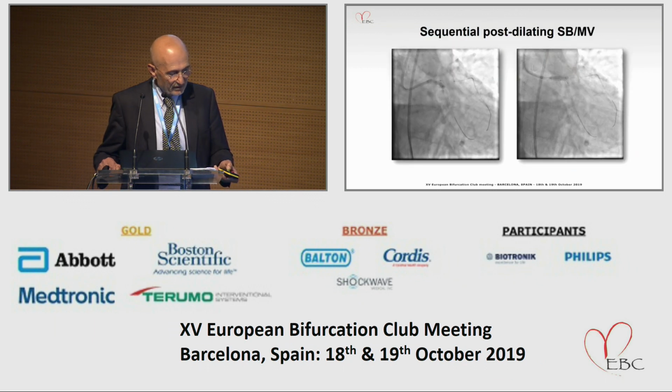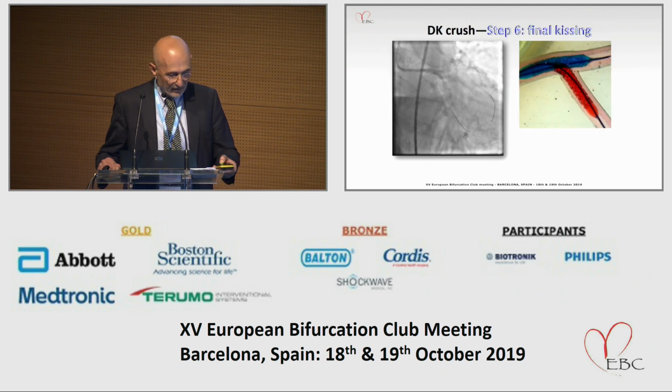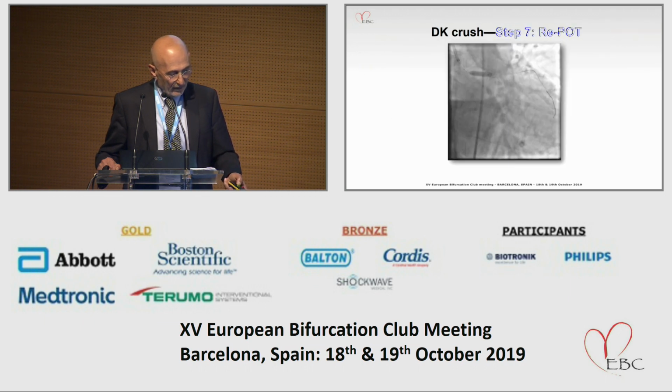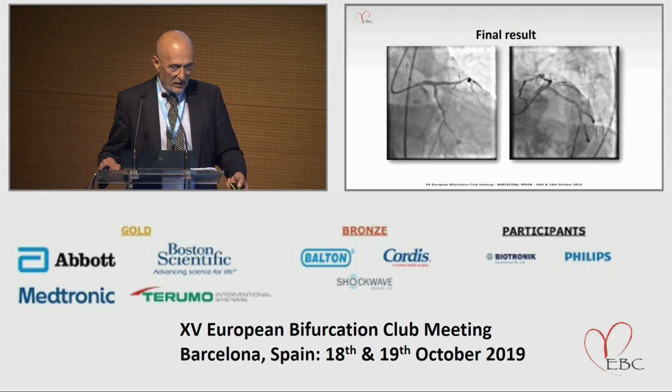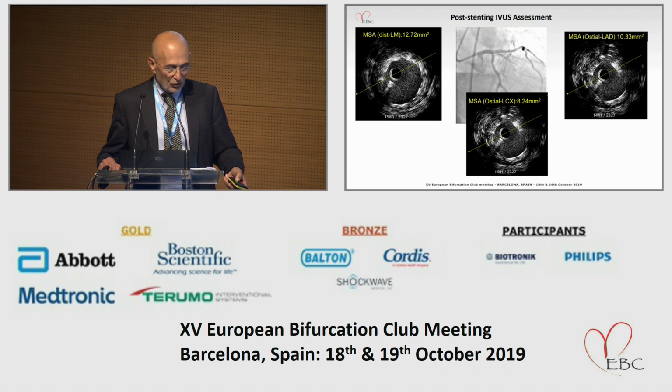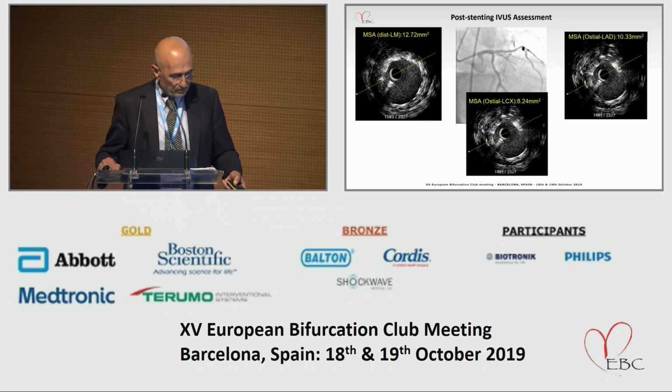And after this, sequential post-dilatation in the side branch and left main vessel, and again final kissing, that means second kissing. And finally, the seventh step is the POT, and this will be the final result. Again, it is highly recommended to be guided by IVUS. The final optimization should be guided by IVUS.